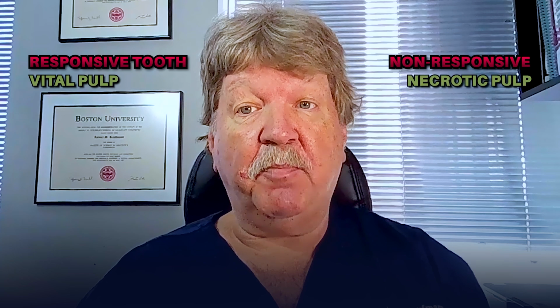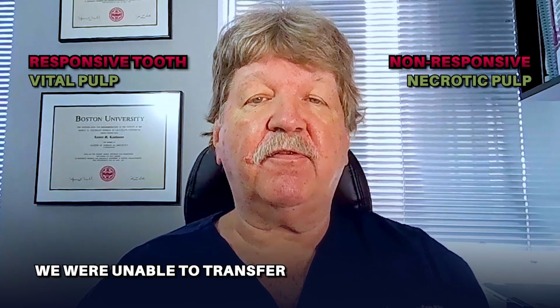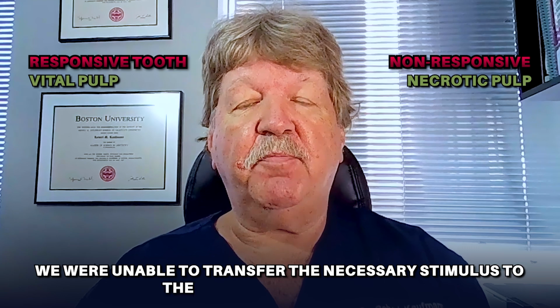We can say that a responsive tooth is more likely to have a vital pulp. However, a non-responsive tooth may have a necrotic pulp, but it also may not be responding because we are unable to transfer the necessary stimulus to the pulp to get a response. This is an important consideration whenever we perform pulp tests as a diagnostic procedure.